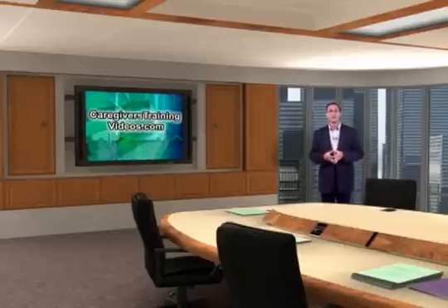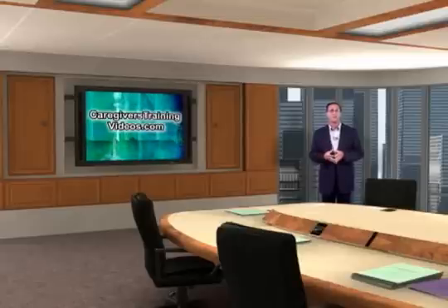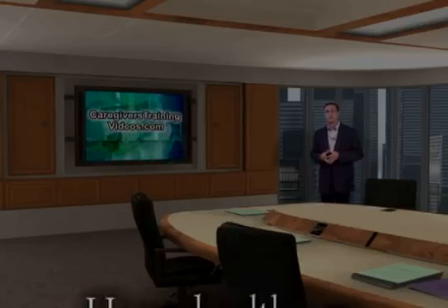Manual patient lifts are hydraulically operated by a pump handle. The power-operated patient lifts are battery or electrical controlled. I will review the battery and electrically controlled patient lifts on a different episode.